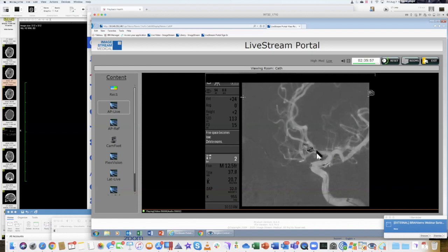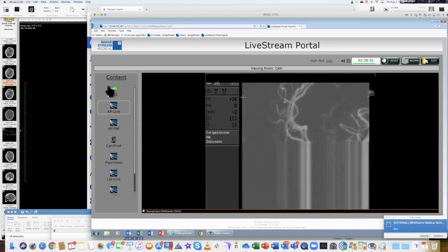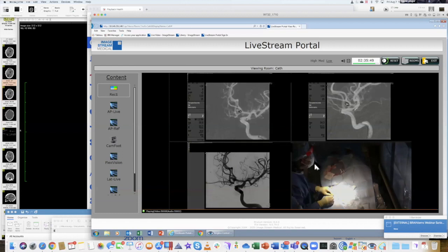That's the back end of the coil going in. Oh, he pulled it back again. See how he's watching very carefully. He's just gently pushing with his fingers. His hands are getting tight. You see that there was a little stress in his wrist, so he was relieving the pressure on his wrists.